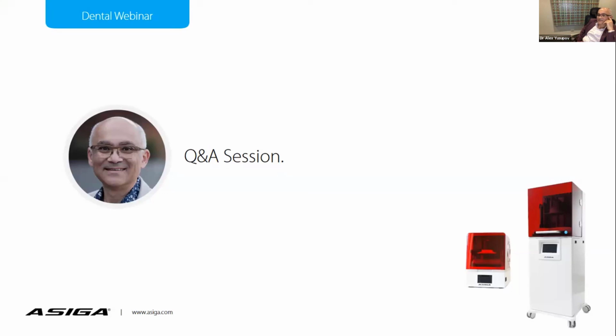And there's also redundancy. If one machine for some reason needs a recalibration, although that hardly ever happens, you can get the job going on the other machine. So it's really nice. I wish I had another 2 little ones or something like that, but we can't justify the volume yet. Yeah, you'll get there.